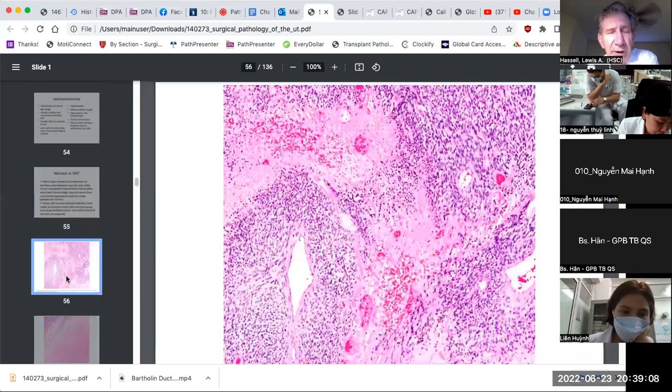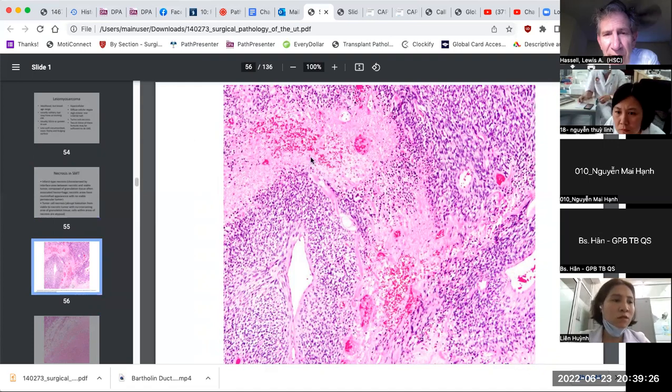Let's go to the next one. So, which is this? Well, this is tumor cell necrosis. There's no transition zone between the necrotic zone and the tumor. We've got perivascular preservation, but then we've got very sharp necrotic tumor.